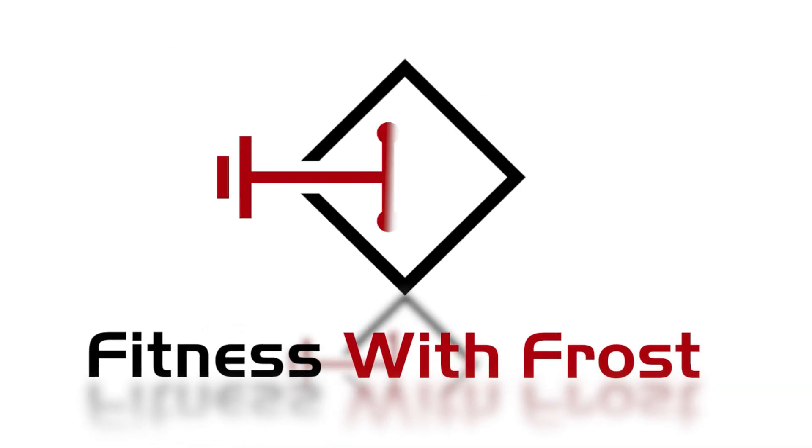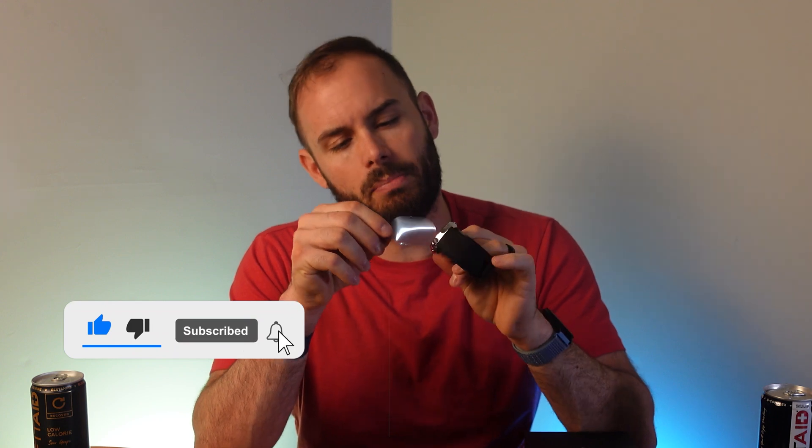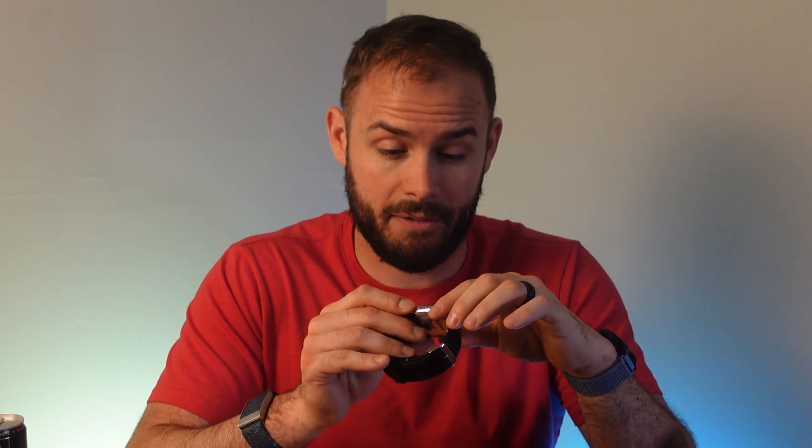The unboxing is very nice — they even sent me a thank-you letter with a little accessory for the smartwatch. You do have to cut a little strip, and when you take it off you'll have all your charging devices along with a pretty thick manual. Taking it out, you can see where it inflates, and it even has a screen cover on it. It does have a little bit of battery already.